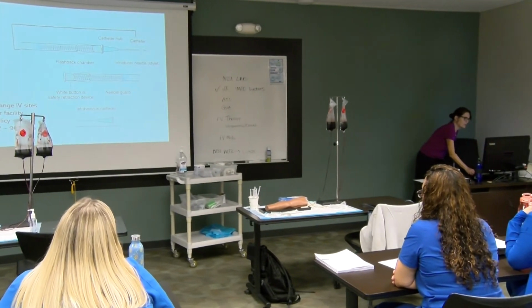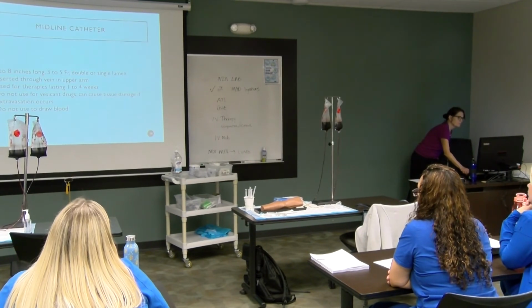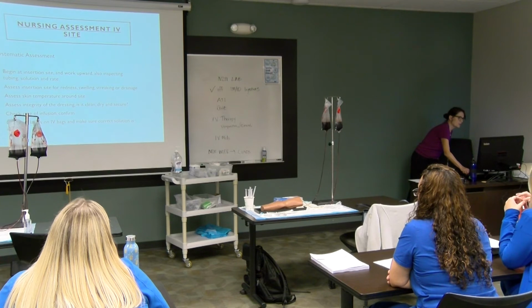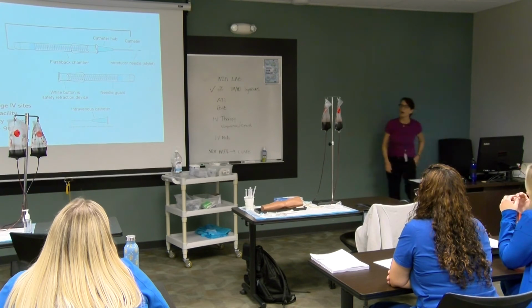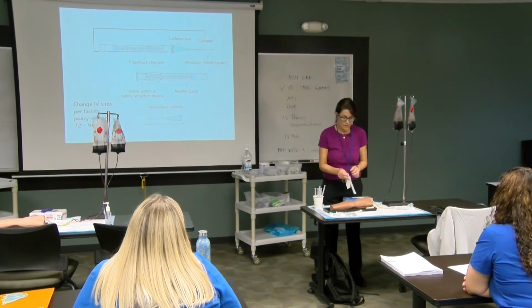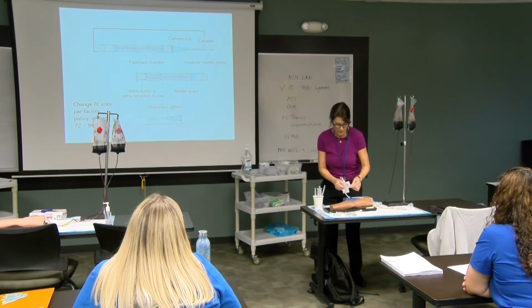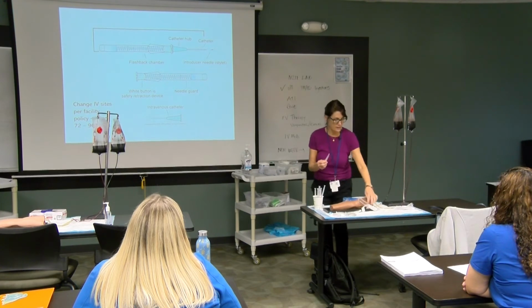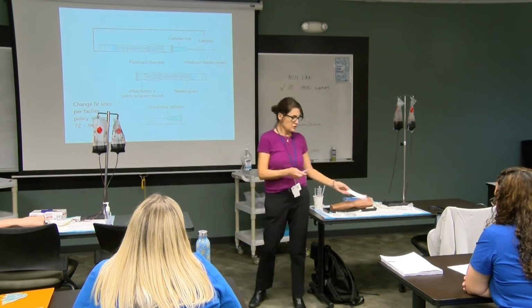A couple things before we get into the actual procedure. I want you to take a look at the IV catheter. I'm going to point out a couple things. As I said, the size is on the back. This is a 22 gauge, 1 inch.